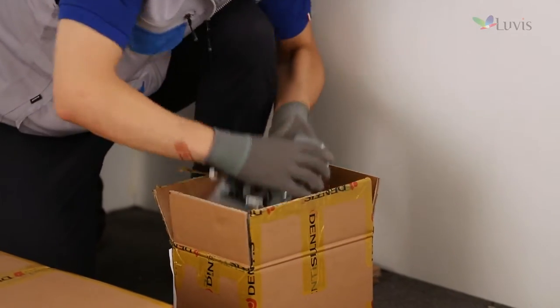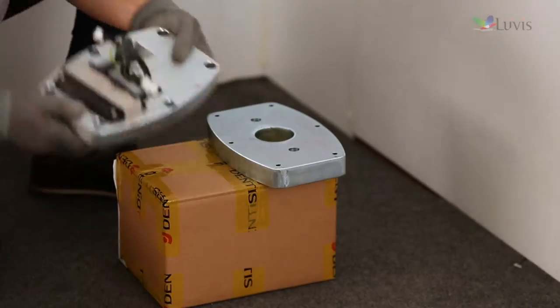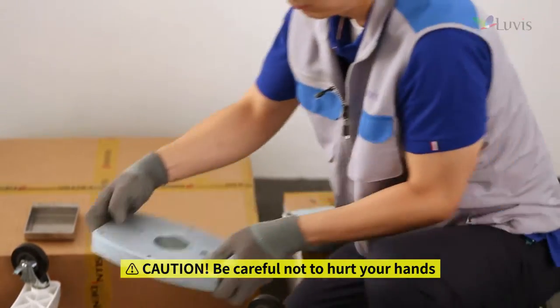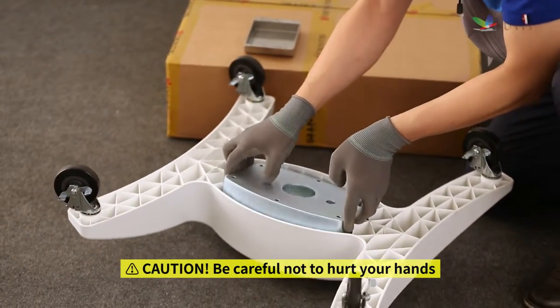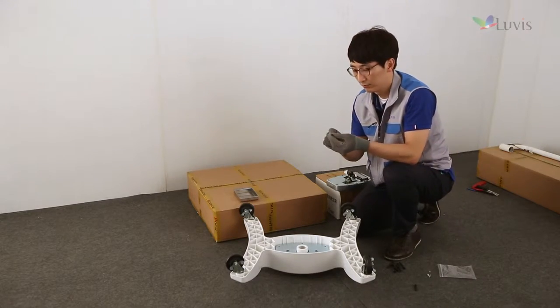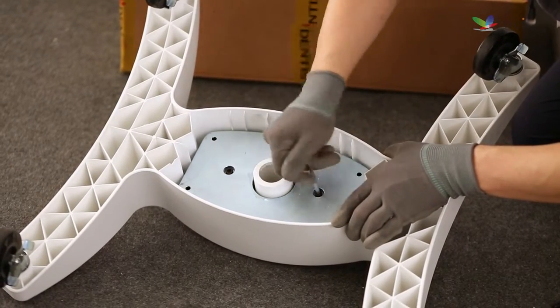Open the base weight and SMPS box. Take out two base weights and one SMPS and check their status. Align the middle groove of base weight number one to the turned-over base body to mount it on. Prepare two screws to fix base weight number one and tighten them with a wrench, regardless of sequence.